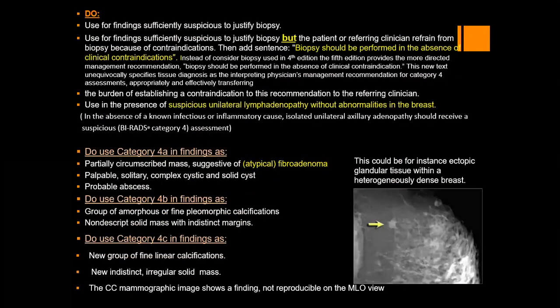Okay, when to do BIRADS 4? If sufficiently suspicious to justify biopsy. If it is sufficiently suspicious to justify biopsy, but the patient or referring physician refrains or doesn't like the biopsy, we have to recommend biopsy and add the sentence: biopsy should be performed in the absence of clinical contraindications.